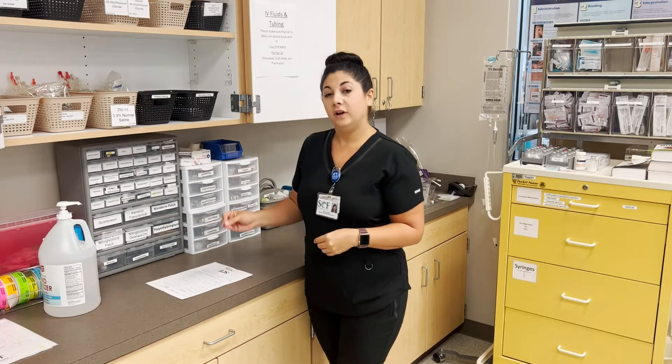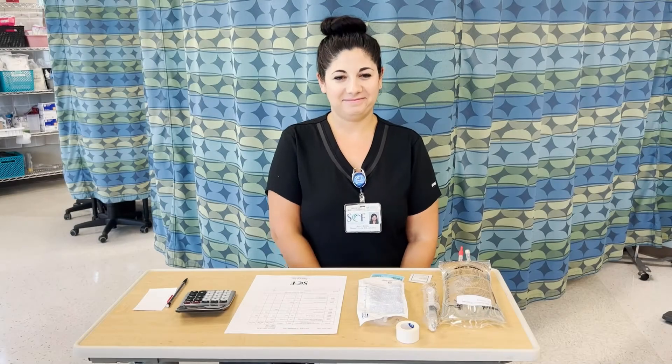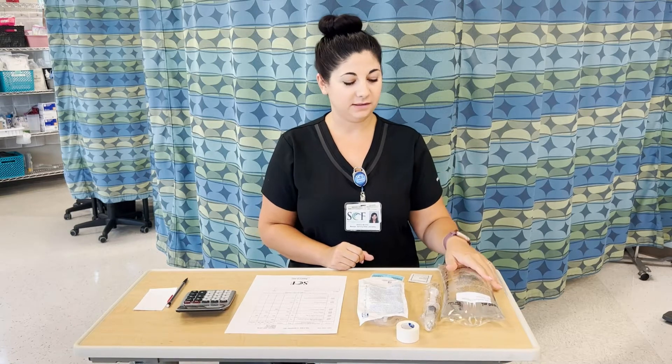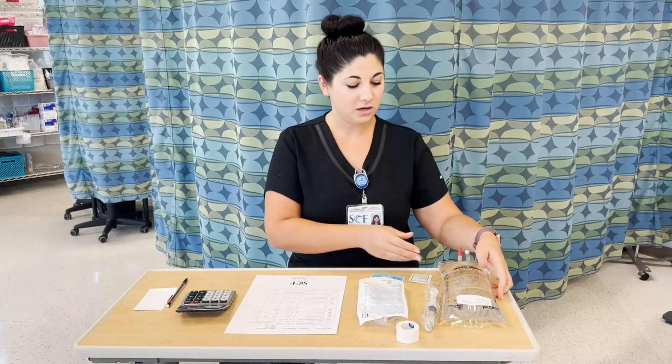Once I have pulled all of my medications, I will grab any supplies that I need. I have already done my first check of my IV fluids at the automated dispensing system. I'm now going to a quiet place to do my second check.